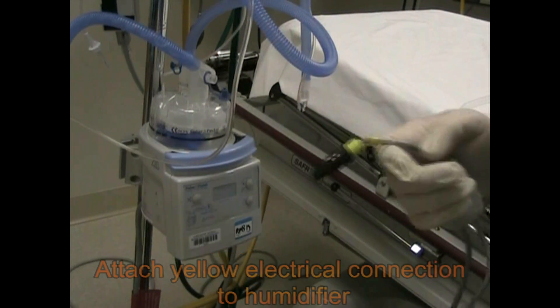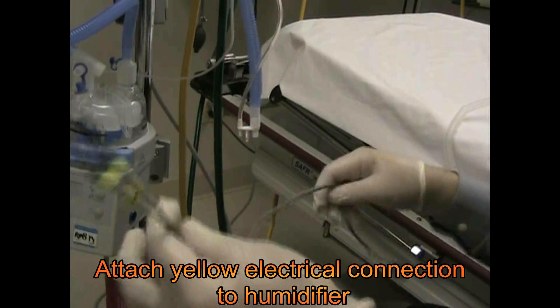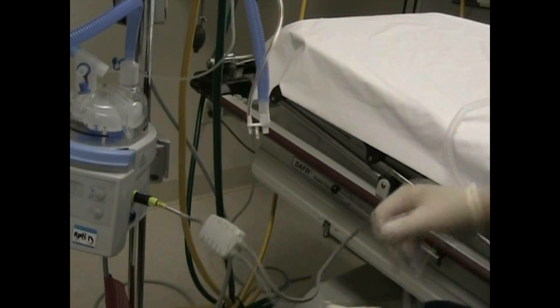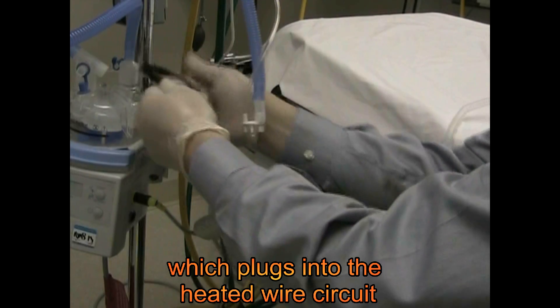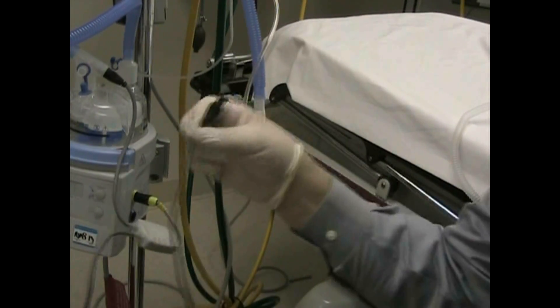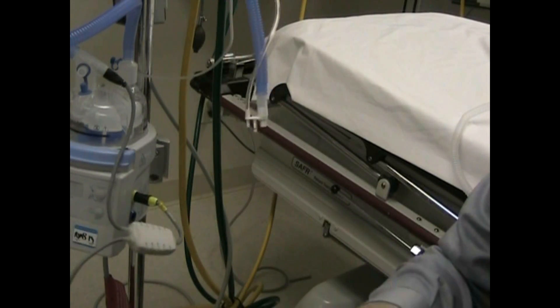The next step is to hook up our heated wire circuit. This is the pigtail and it fits right down here in this yellow port — it snaps in. Then you're going to take the shorter of the two and plug it right into your heated wire system, line it up, push it in, and you're all set. This extra one is for the exhaled circuit, which we're not going to be using, so we'll just let that drop.